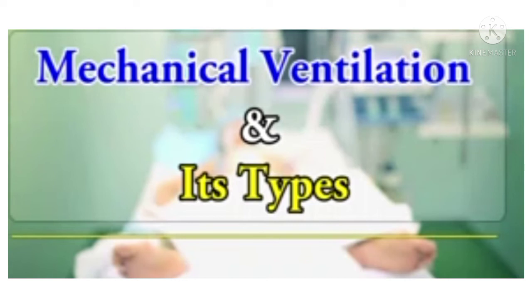Pressure ventilation: with pressure ventilation, the peak inspiratory pressure is predetermined, and the VT delivered to the patient varies based on the selected pressure and compliance and resistance factors of the patient ventilator system. With this understanding, careful attention must be given to the VT to prevent an unplanned hyperventilation or hypoventilation. For example, when the patient breathes out of synchrony with the ventilator, the pressure limit may be reached quickly, and the volume of gas delivered may be small.